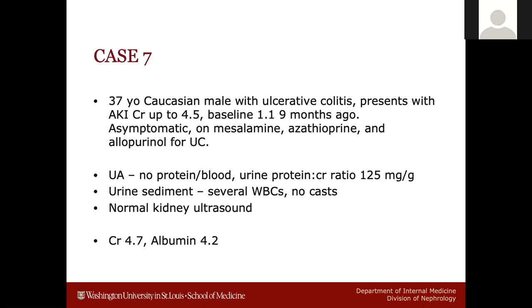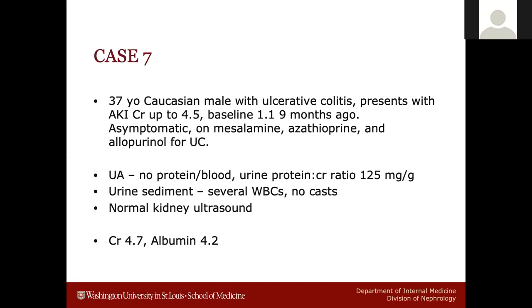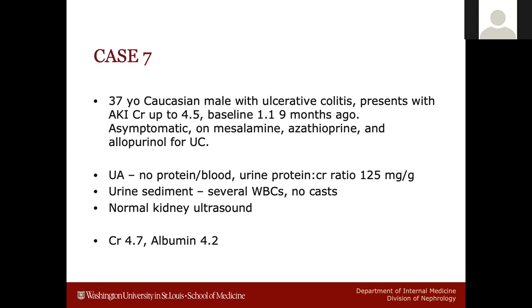Especially with the mesalamine. Ulcerative colitis can cause IgA, but then you would expect hematuria and maybe non-nephrotic proteinuria. The absence of blood on the sediment and the minimal proteinuria push you away from a glomerular etiology. So keep AIN and IgA on your differential. Let's look at the tissue.